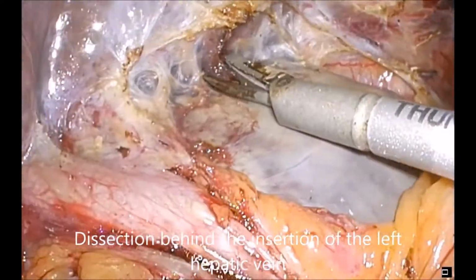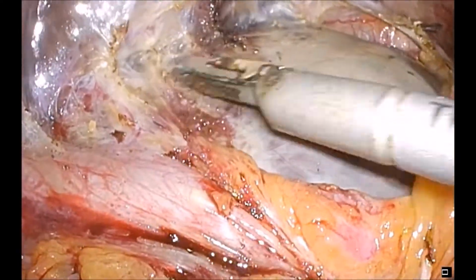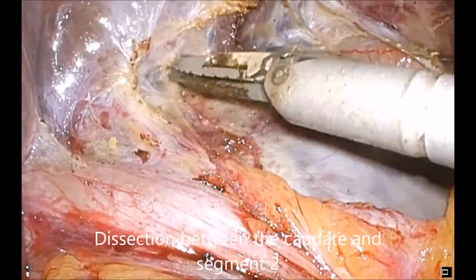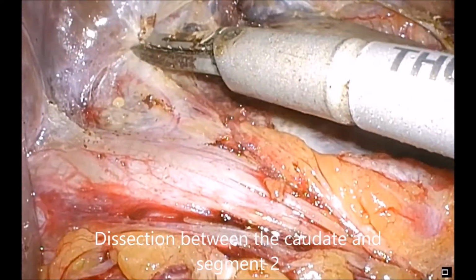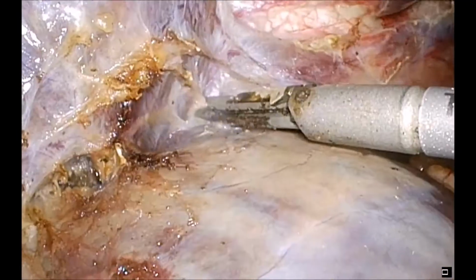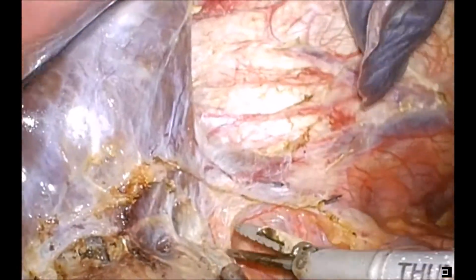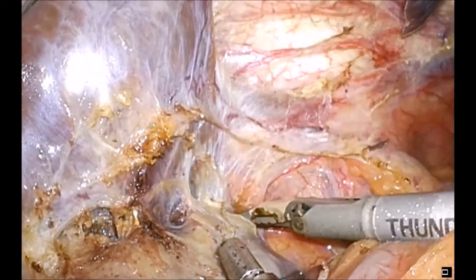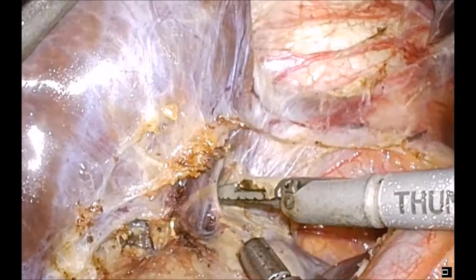Dissection continues behind the insertion of the left hepatic vein into the cava and down along the front of the caudate lobe as it joins the left lobe of the liver in the groove for the ligamentum venosum. Further areolar tissue is taken up around the inferior vena cava.